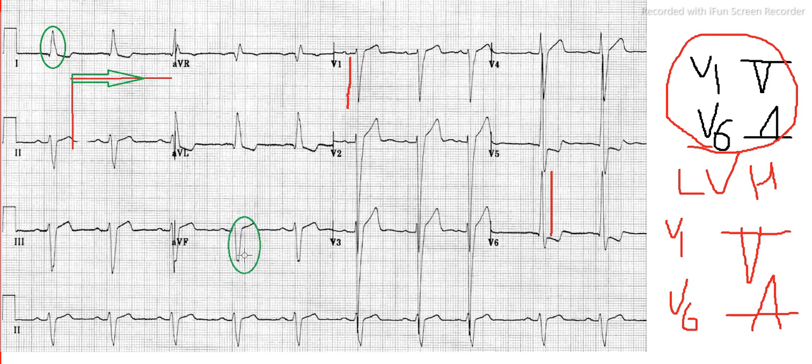When we draw that vectorial representation, negative means it is going upward. This is the representation of QRS depolarization in lead AVF, because it is negatively deflected, so it is going in the opposite direction.